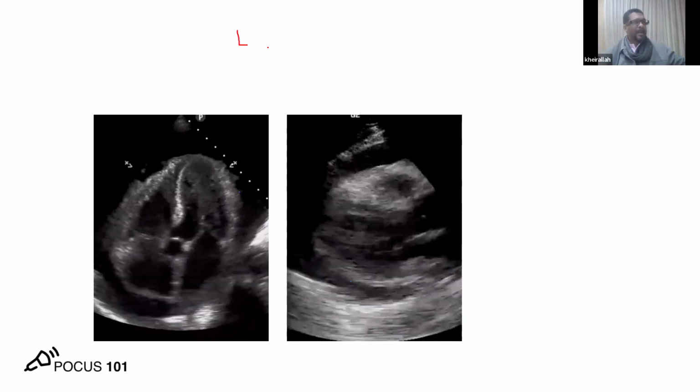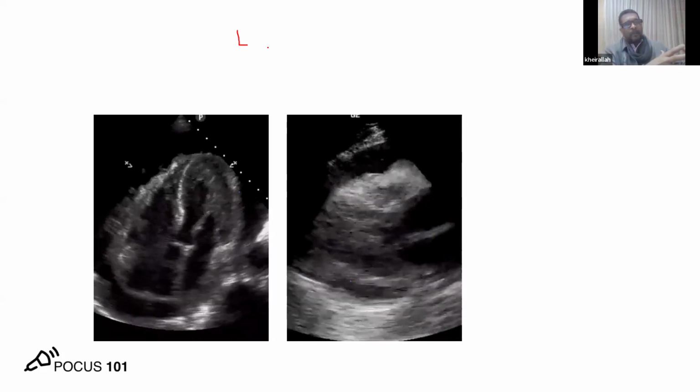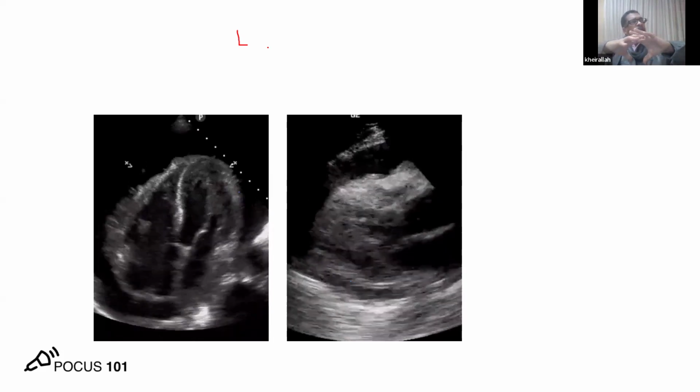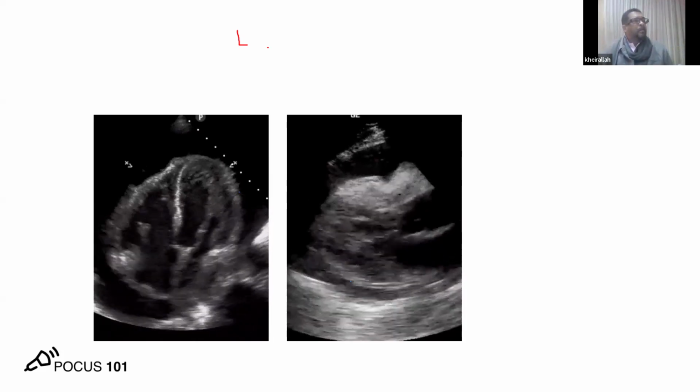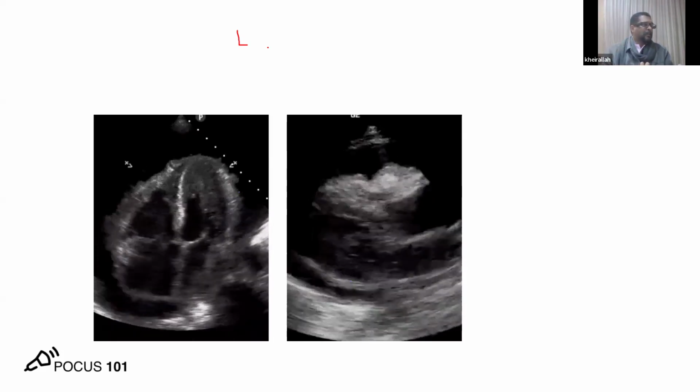Not only that, even the consequences of that, the LA dilatation, the pulmonary artery systolic pressure, the status of the LV. So you have to give a complete picture about the consequences of this disease on the heart.